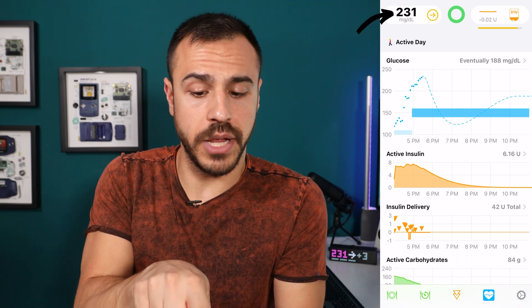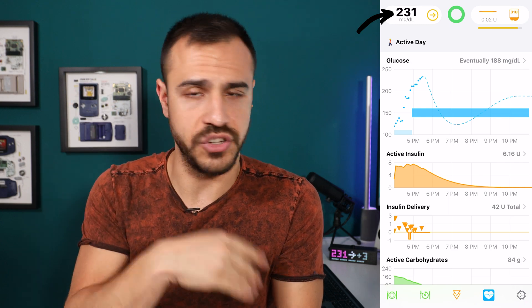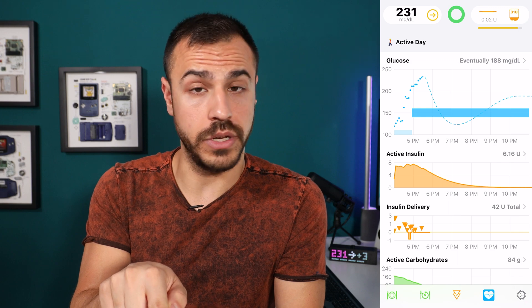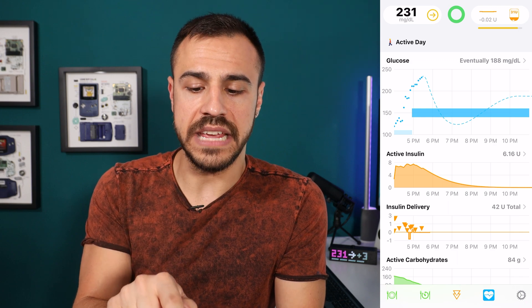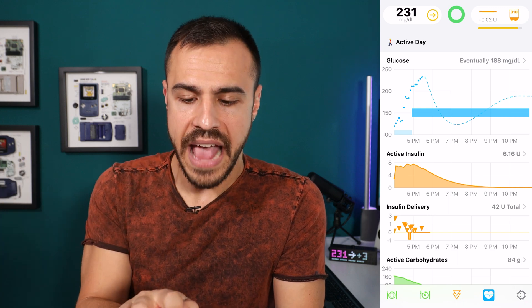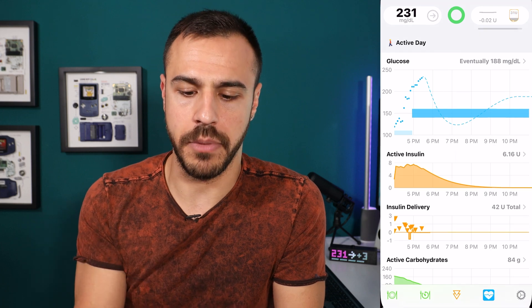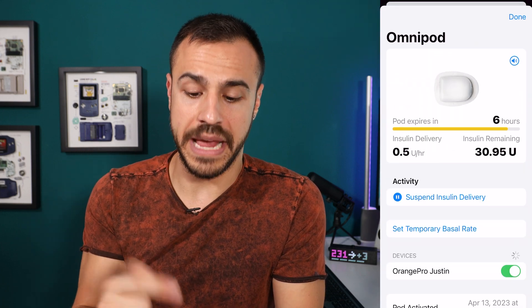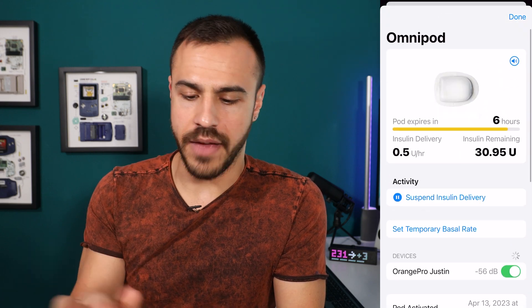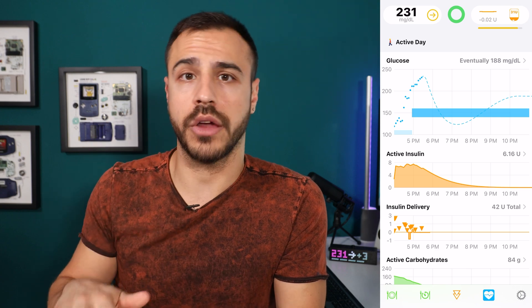On top, you can see my blood sugar. That green Loop in the middle means it is connected to the pod and the CGM — everything is working fine. In the top right, you can see 31 units are in my pod. You can see the temp basal — it's negative 0.02, coming back on basal. That orange line shows the lifespan of my pump. If I tap into there, it shows me I have six hours left on my pump. There are lots more settings that I'm not going to get into — I will have a full app walkthrough, so stay tuned for that.